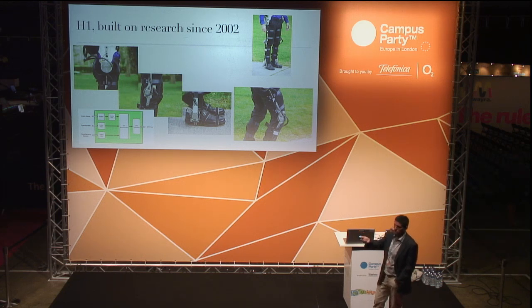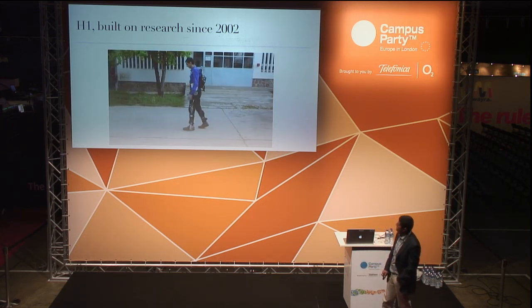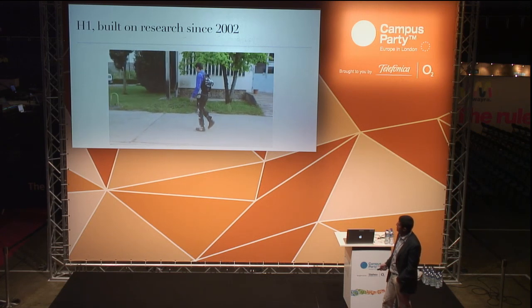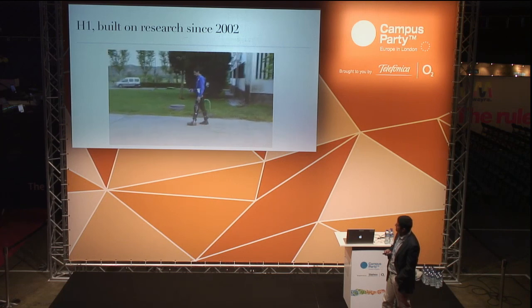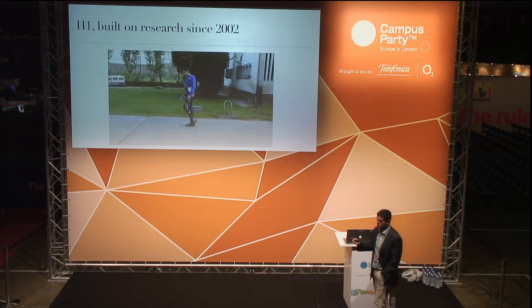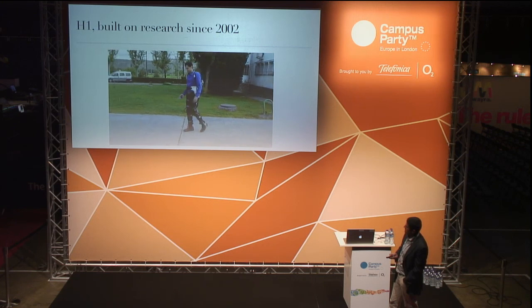Several details of the technologies that we are using. We are using DC motors together with harmonic drive transmissions at the different joints of the exoskeleton. Again, we have the sensors integrated in the different joints. This is just a video of MAGDO in our labs working with the exoskeleton. He's using this user interface that is programmed in this mobile phone to start the system and to change the speed of the system. You will see now how it is being changed. Now he's just changing the walking speed, and you see now that it's much slower. At this point, he's speeding up again the operation of the system.